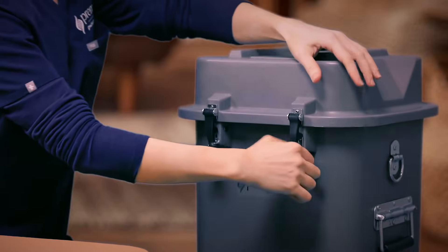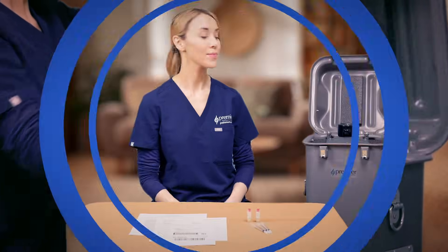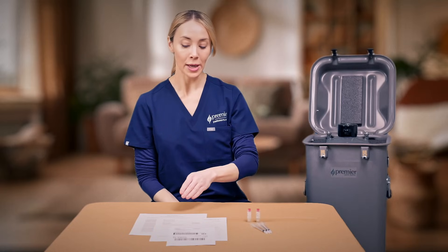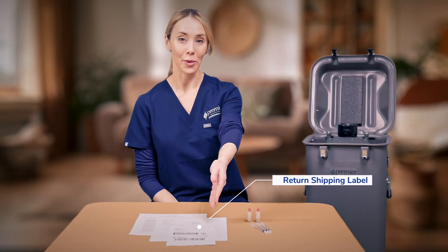Once your shipment arrives, open the container and check for the following items: the tank containing your sperm vials, syringes, insemination instructions, packing slip, and return shipping label.